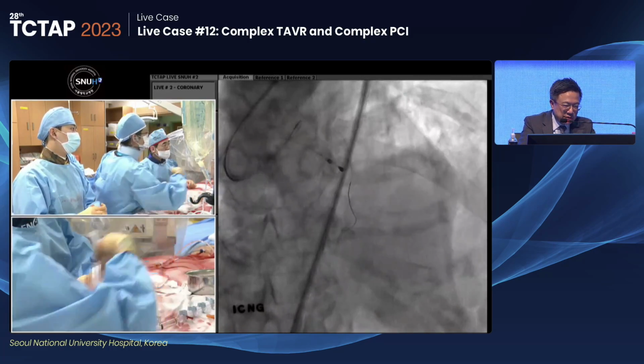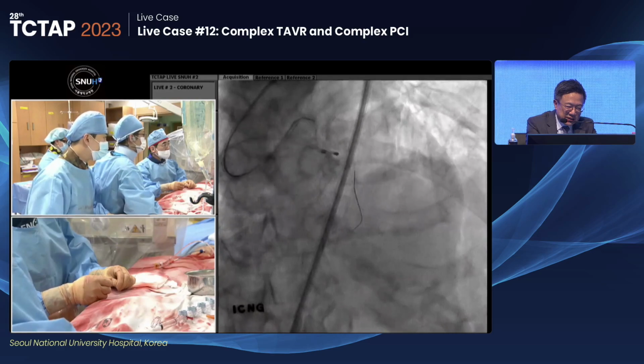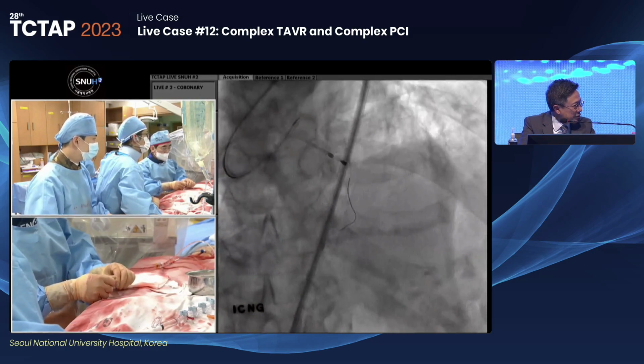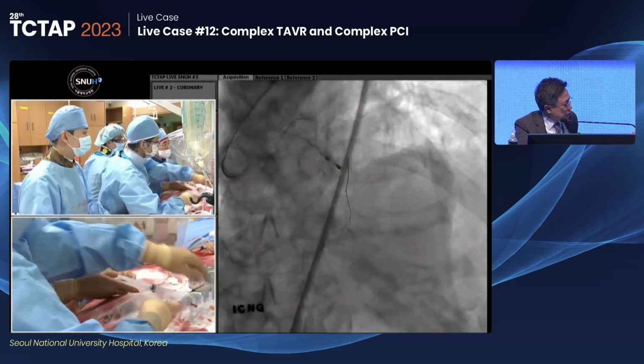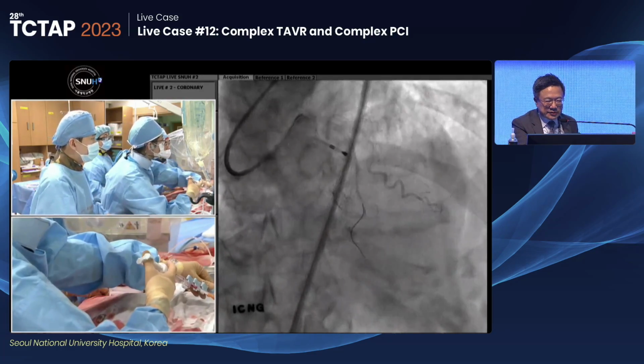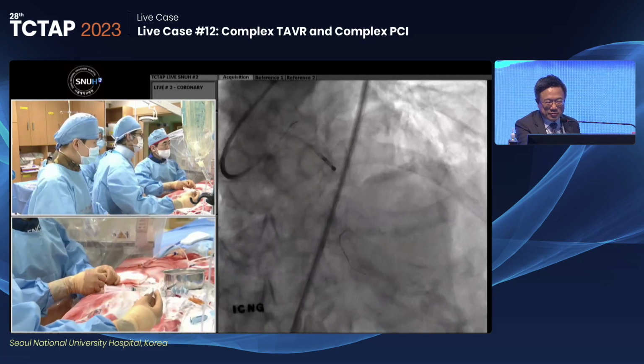I don't think a stent would go down. The challenge on the left side is, how do you wire this thing with the rotablator wire? I think you need a regular wire and then a microcatheter exchange, but the microcatheter may not even go down.